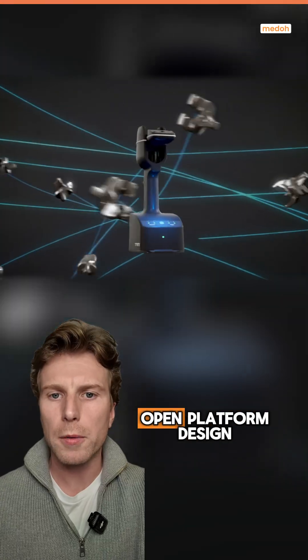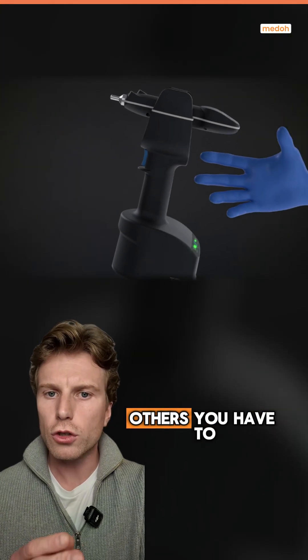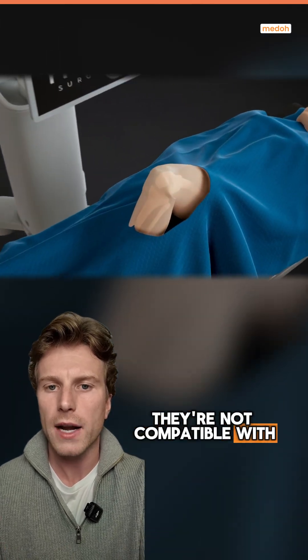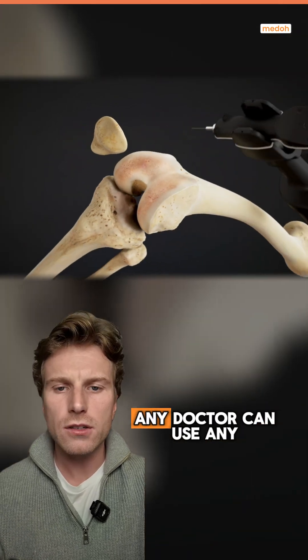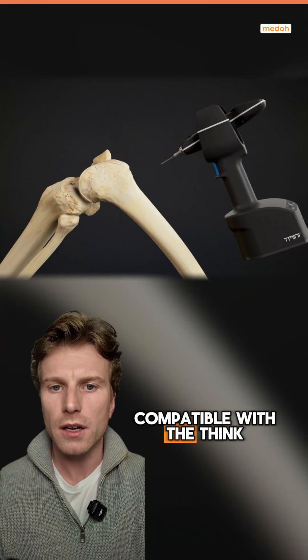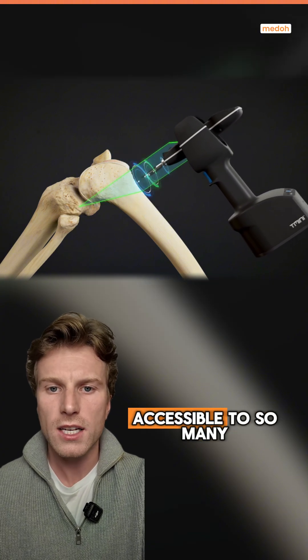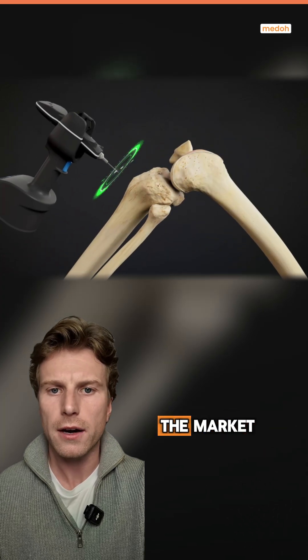The second aspect is its open platform design, which is completely different to other robotic knee replacements on the market. With others, you have to use the robotic arm from one company and also use their implants — they're not compatible with anything else. But Think Surgical is the complete opposite. It's a completely open platform, meaning any doctor can use any total knee replacement and it will be compatible with the Think Surgical instruments. This is huge because the doctor doesn't have to change their workflow, making the robotic system far more accessible to many more doctors and a huge differentiating factor compared to competitors currently on the market.